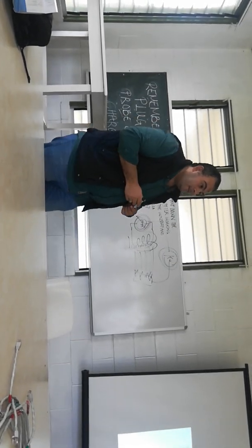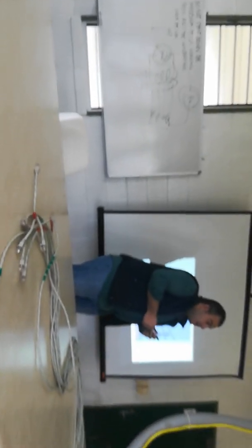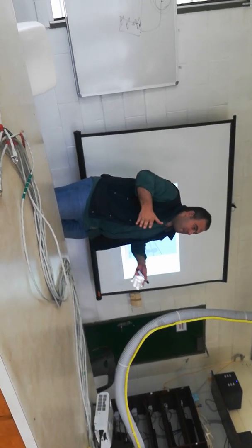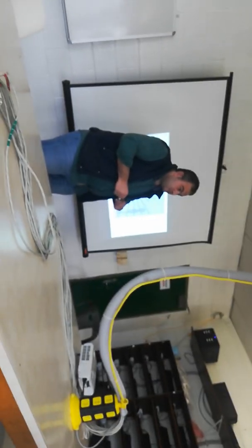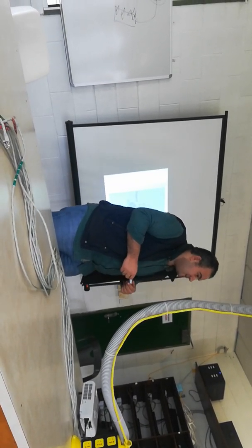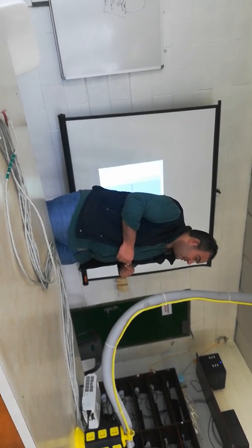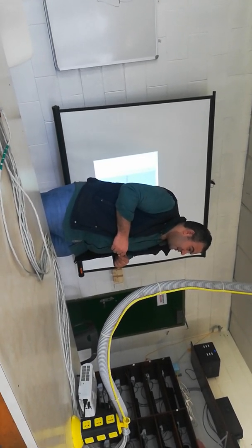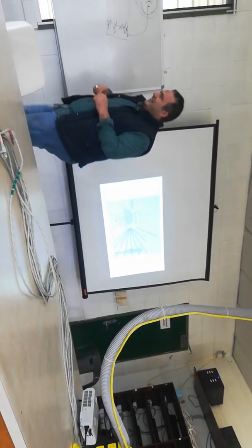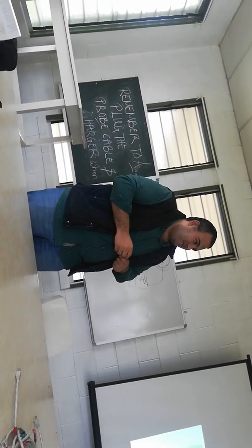So in other words, in order to increase the current of electrons, we need to increase the milliampere, the current flux, to make it more. But to make the penetration power greater, kV. So for example, to expose the bone, we need to increase kV or milliampere. It depends on the image formation for X-ray or CT.